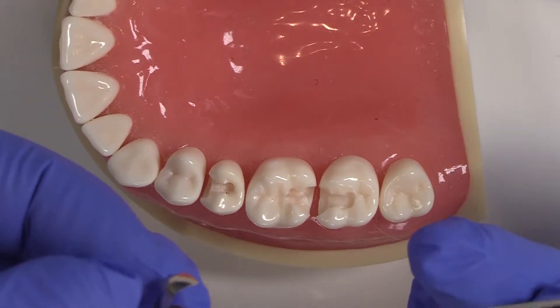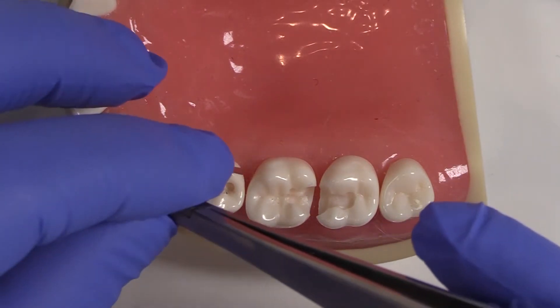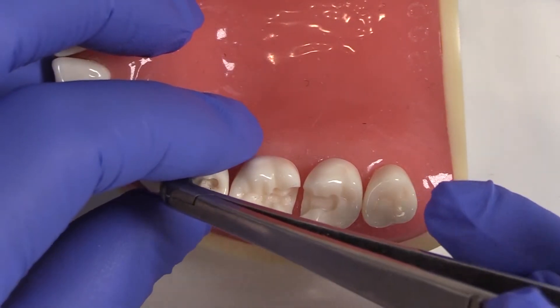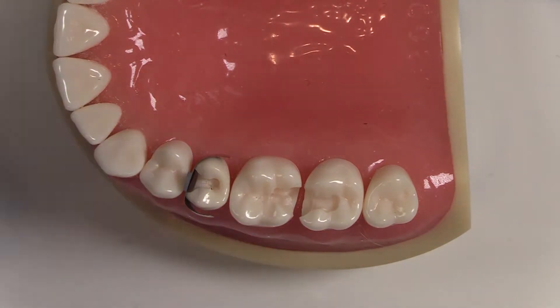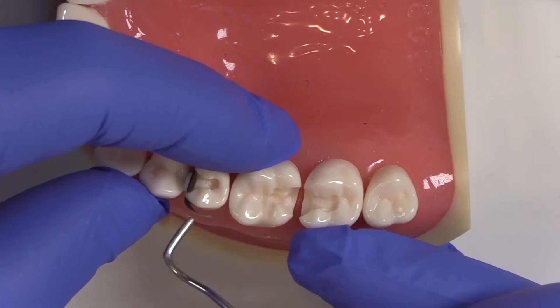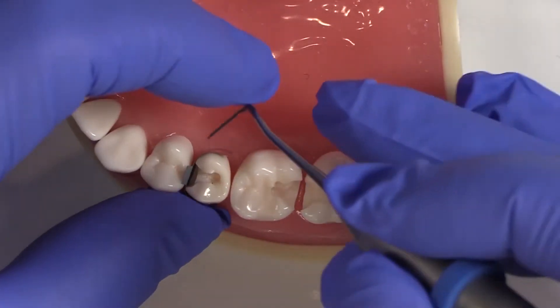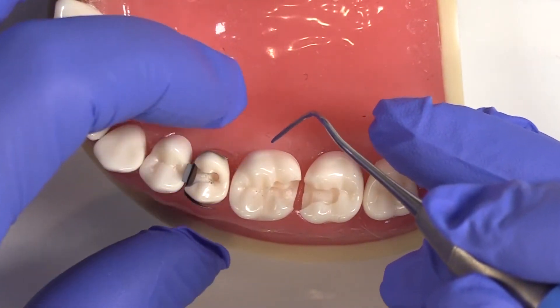You can also bend just a little bit back so I get a better path of insertion. I come in here and try to use my fingers, but if I have any issue, I can use an instrument such as this blue instrument here and guide the matrix band into the sulcus — both buccal and lingual — especially when I use rubber dam.